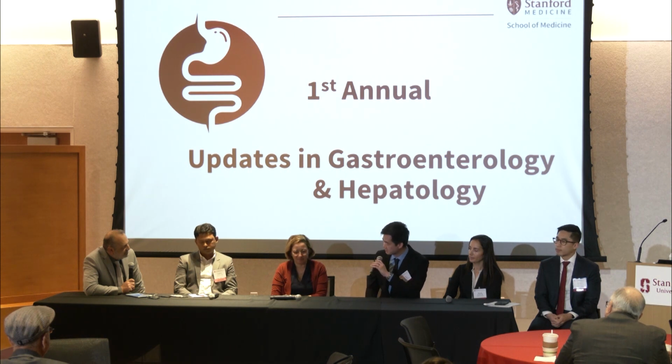Yeah, good question. So in terms of FDA approval, I think the one thing that I do note is that it's not FDA approved for patients who've had belly surgery. And so definitely for patients who've had recent belly surgery, I would not consider it. Remote history of belly surgery, I think twice about it and definitely have a longer conversation with patients if we are going to do it and describe that it's not actually FDA approved for that indication.